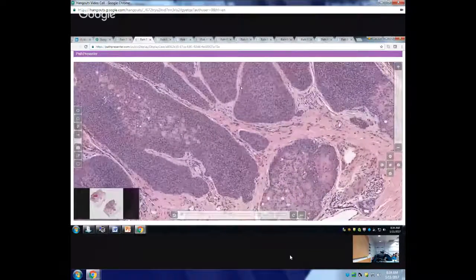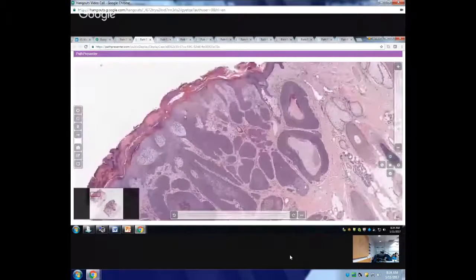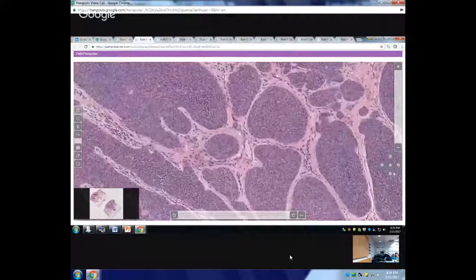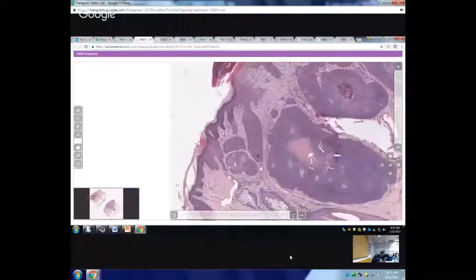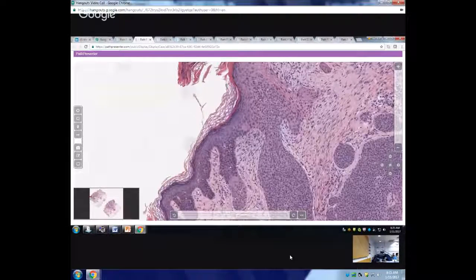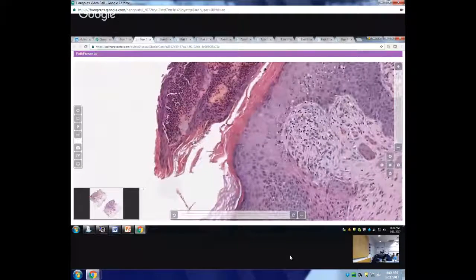So it can even go into the dermis actually, but it always starts from the epidermis. There again you can see the basaloid neoplasm, a lot of blood vessels in the stroma, and then sharp demarcation from the normal epidermis. See the sharp demarcation? Look at this lesion and this is the normal epidermis. Again, very sharp demarcation actually. And the blood vessels in the stroma.